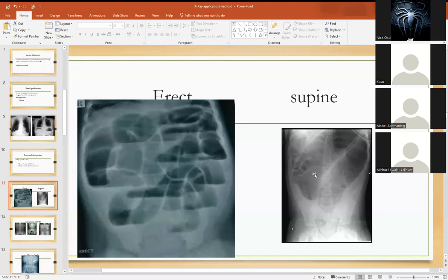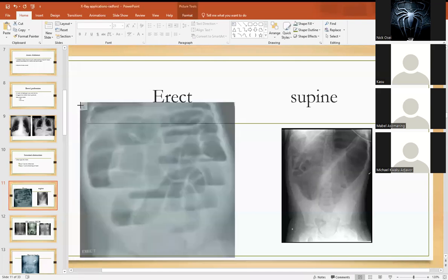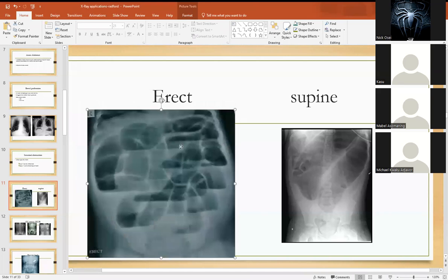This is a patient who had a sigmoid volvulus — that is twisting of the sigmoid colon on itself. On the erect view on the left, you can see that there are multiple air fluid levels. You see a radio-opacity below with air above it, and that pattern repeats multiple times all the way through — that is the erect view showing air fluid levels.